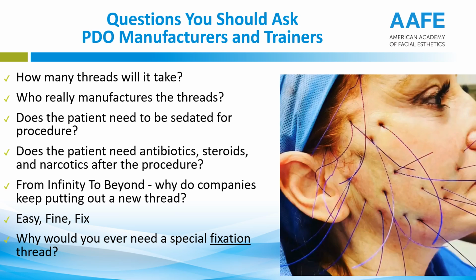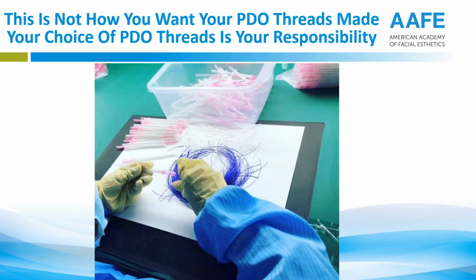Another thing, and because this is such a huge problem right now, especially in the US here, this is not how you want your PDO threads made. They should not be touched by human hands. And this is a huge problem, again, because there are 3 or 4 manufacturers globally that are all automated, that put out the best PDO threads. And then there's lots of other manufacturers that are just doing it by hand.